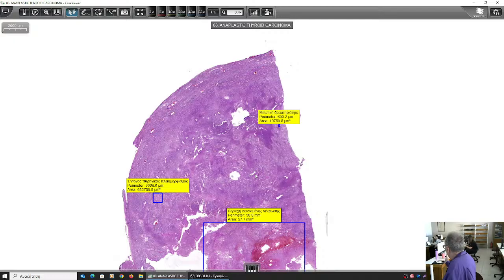Morphology does not help us. It is undifferentiated morphologically. So we have to perform immunohistochemistry, and hopefully some degree of a panepithelial immunomarker will stain some parts, at least, hopefully, some parts of this tumor.